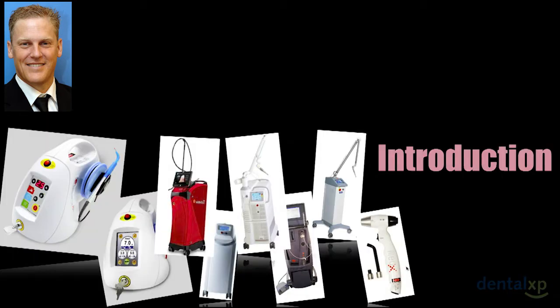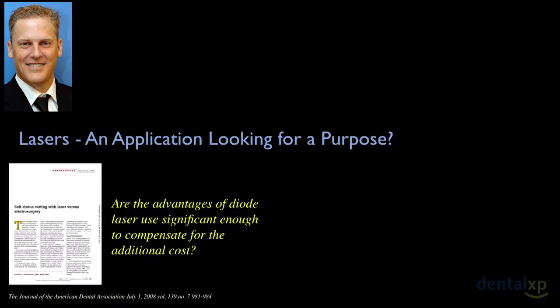We begin with an introduction. There's a myriad of lasers out there, confusing indeed. And when you look back at Gordon Christensen in 2008, when comparing diode lasers and electrosurge, he asked, are the advantages of a diode laser enough to compensate for the increase in cost? At that time, those little units were about $15,000, and they're now down around $3,000.